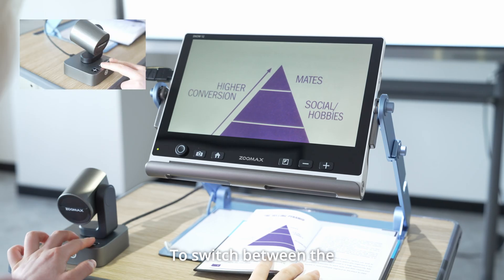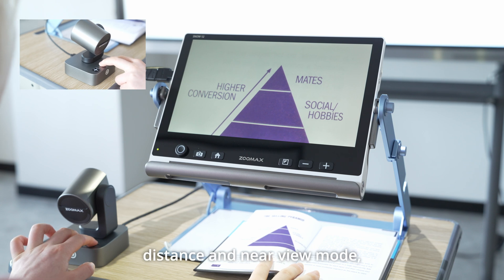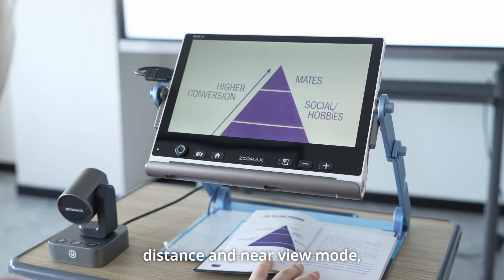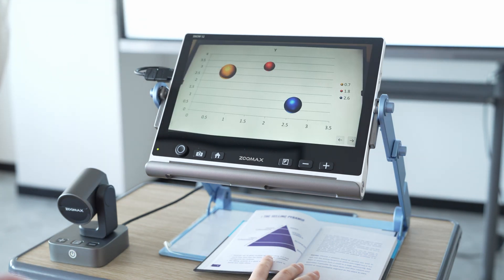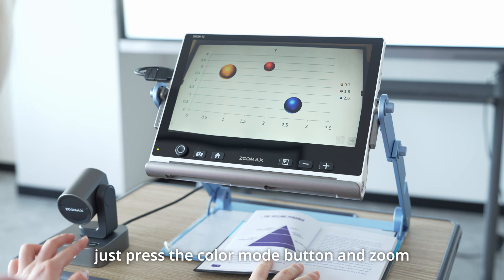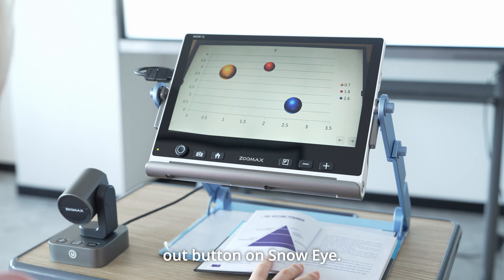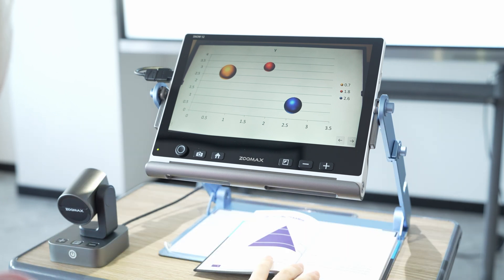To switch between the distance and near view mode, just press the color mode button and zoom out button on Snow Eye.